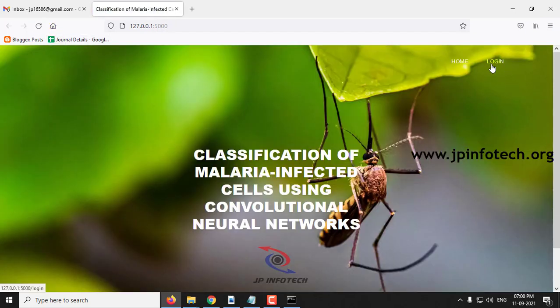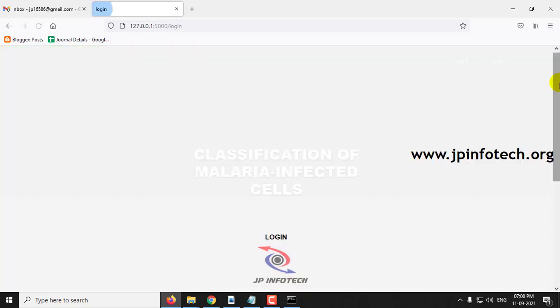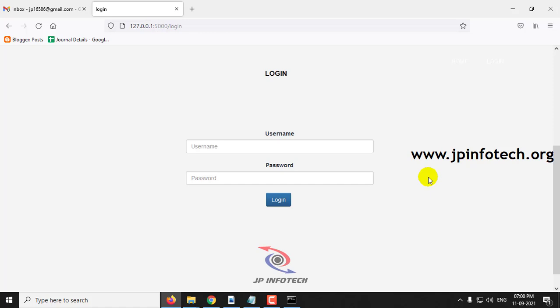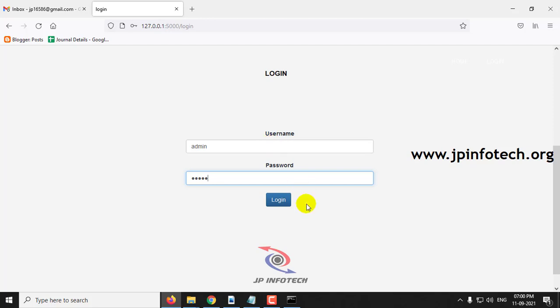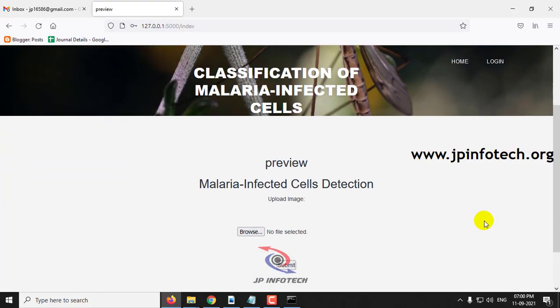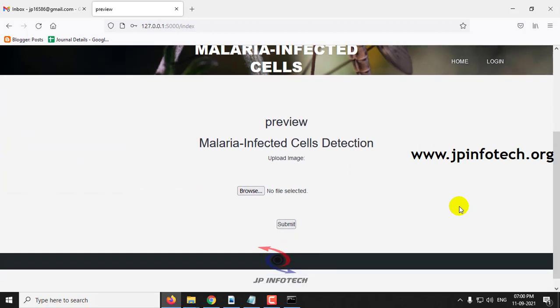Here you can see the login menu. Click login and you will see the username and password fields. Note that this is a static login page because we have not used any database here. Enter the default username and password as admin and admin, then click login. Once login is successful, you will be navigated to the preview part where you can upload an infected or non-infected image and check the prediction result.